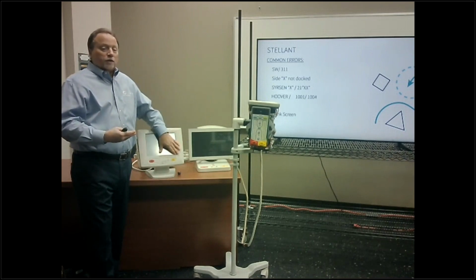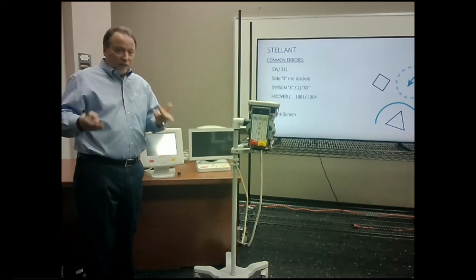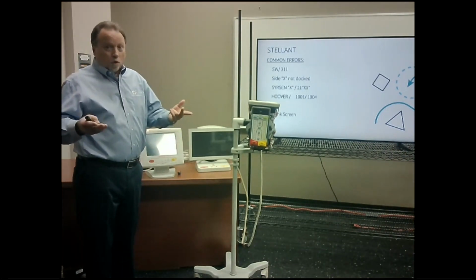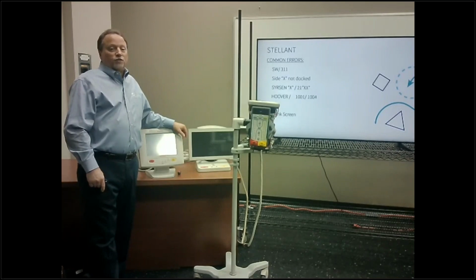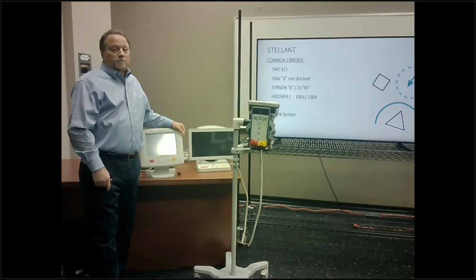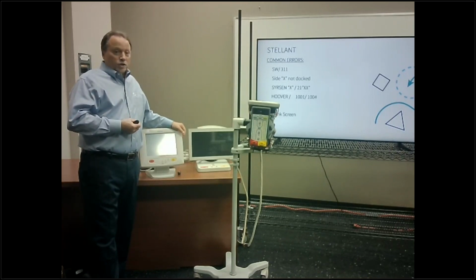A blank screen is either going to be mismatched software, which I doubt is going to happen because you haven't changed anything around, or you have a bad connection someplace. Along with the 1319. A 1319 can give you a blank screen also. It'll just come up and go 1319. A 1319 is also a bad connection. A lot of times, just reseating your cables will resolve that issue.